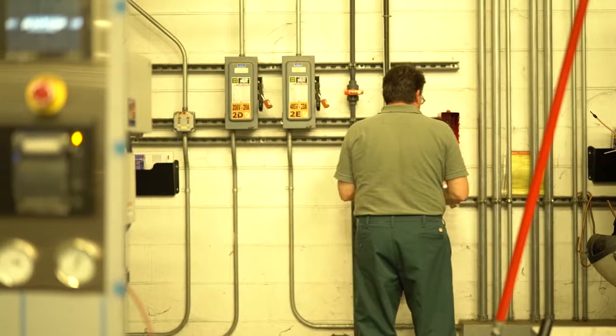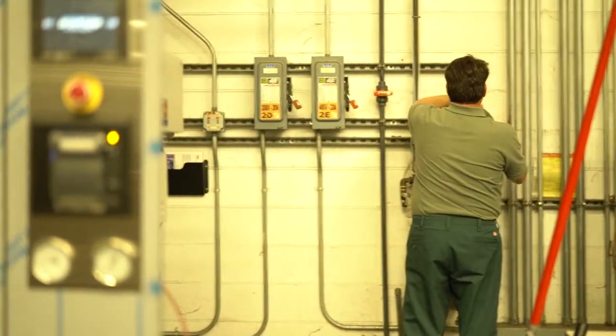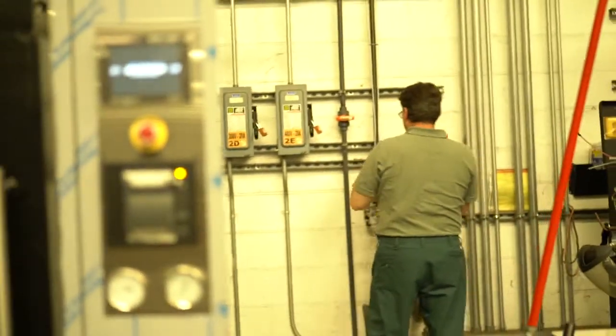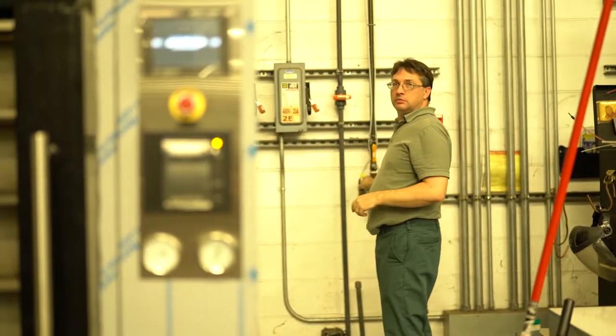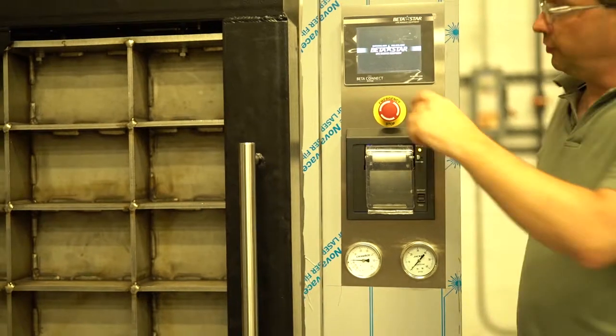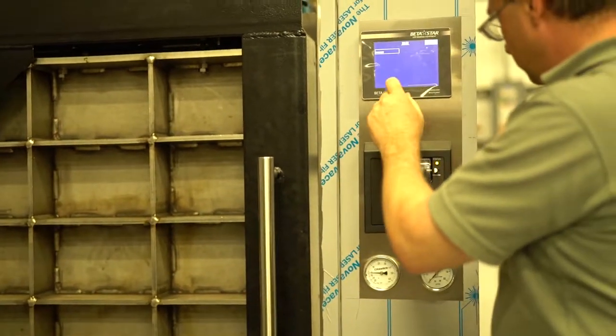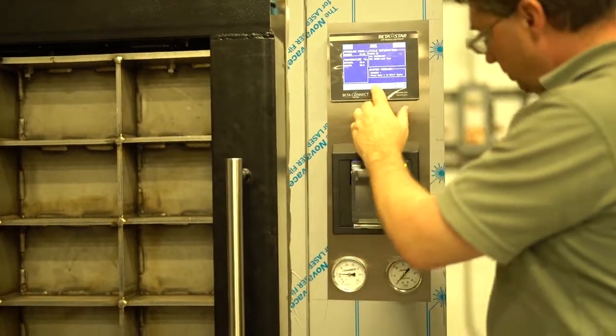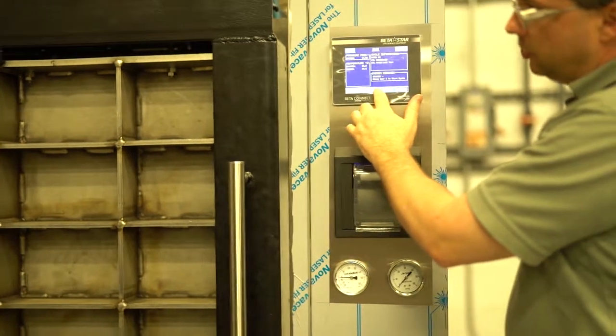Before a single sterilizer leaves Betastar headquarters, each unit must pass a factory acceptance test to ensure all utilities and components function correctly. This test includes running a cycle to completion, verification of door function, alarms testing, and cycle printout data.